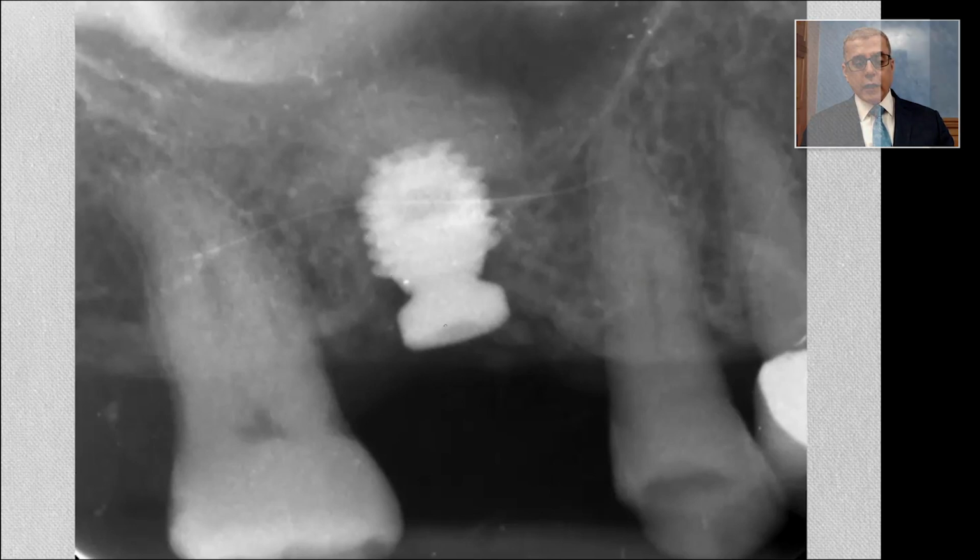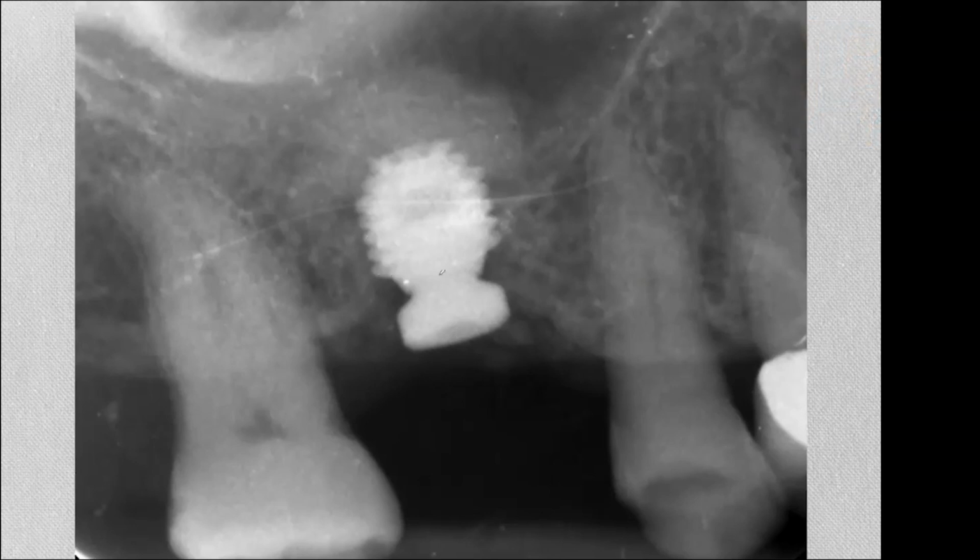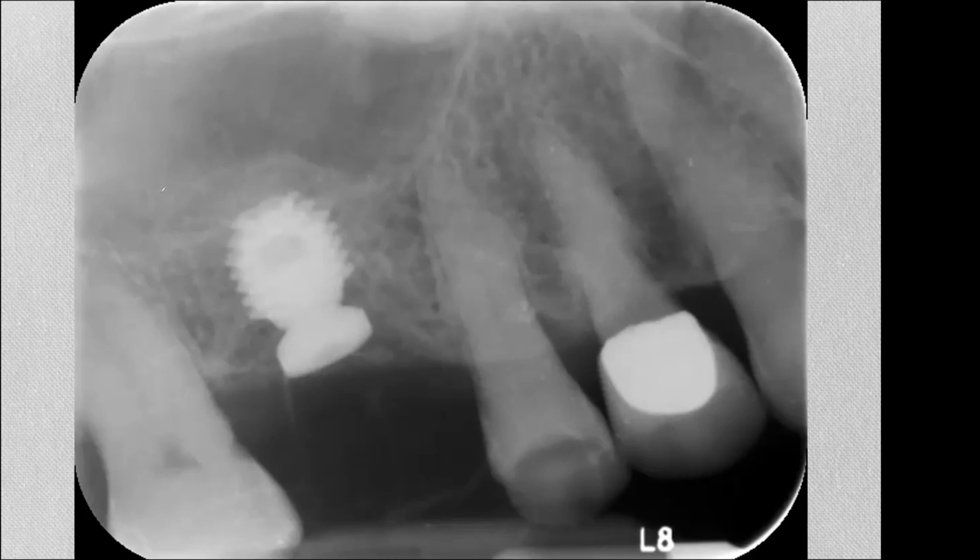But look at the orientation. And I was able to seat it more deeply so that I can bypass that slightly lower or thinner palatal plate without fear. And the amount of the sinus that we grafted and lifted is significant, almost equal to a small conservative lateral lift. And after about 5 months, the patient comes back and we have new native bone.